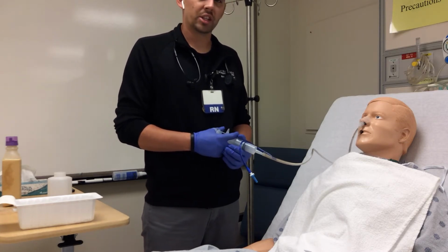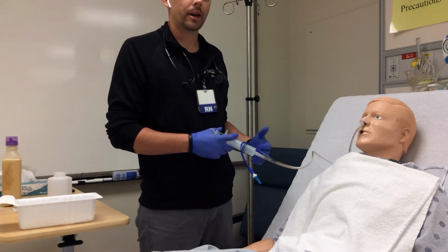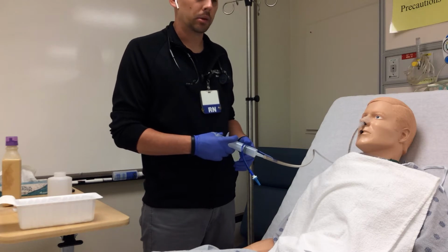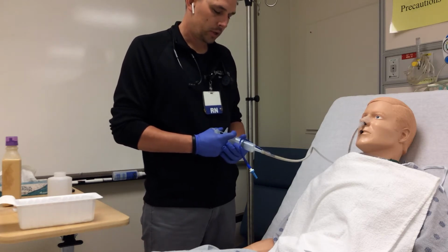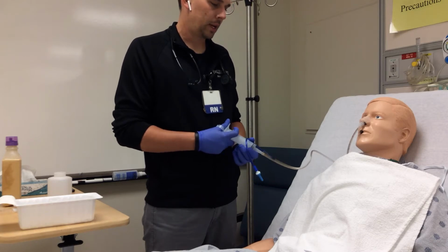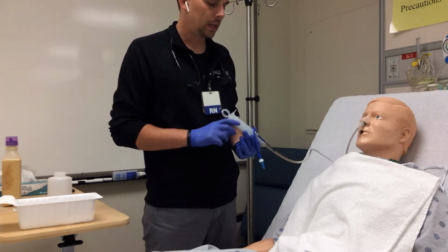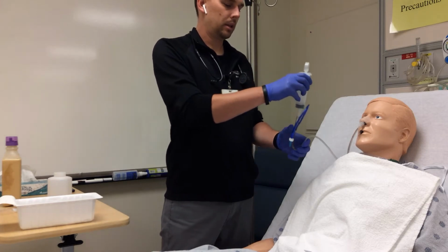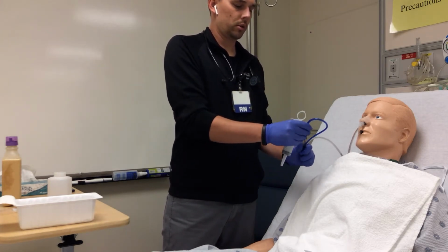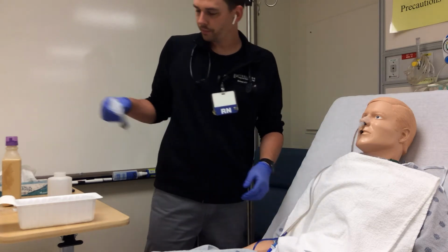You also may want to review physician orders. Some physicians may specify how much gastric residual volume that they want to keep. So we will return that 30 mLs of gastric residual volume. We know the patient is tolerating previous feedings okay if they've had any. We have confirmed placement. I'm going to clamp, remove my syringe, and replug.